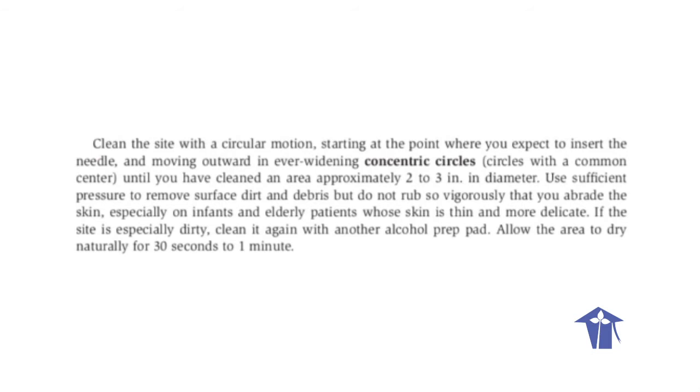Clean the site with a circular motion, starting at the point where you expect to insert the needle and moving outward in ever-widening concentric circles until you have cleaned an area approximately 2 to 3 inches in diameter. Use sufficient pressure to remove surface dirt and debris, but do not rub so vigorously that you abrade the skin, especially on infants and elderly patients whose skin is thin and more delicate. If the site is especially dirty, clean it again with another alcohol prep pad. Allow the area to dry naturally for 30 seconds to 1 minute.